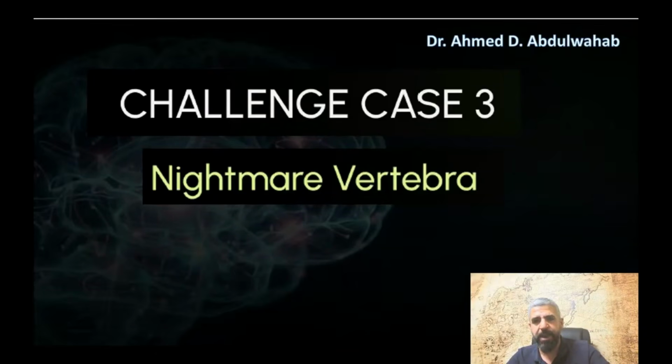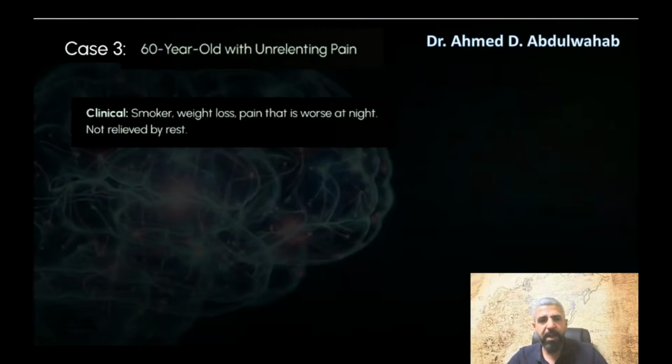It's called the nightmare vertebrae. So let's look at the history. This is a 60-year-old male patient. He's a heavy smoker. He has back pain that keeps him awake at night. He says, "Doctor, the pain is worse when I lie down." That's a red flag. Night pain is the detective's biggest warning sign. Night pain is a bad sign.